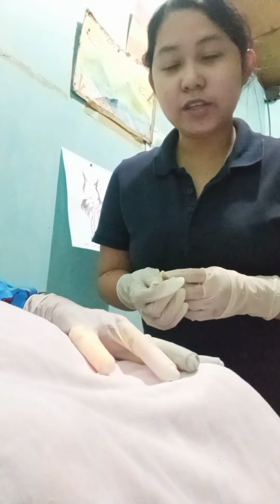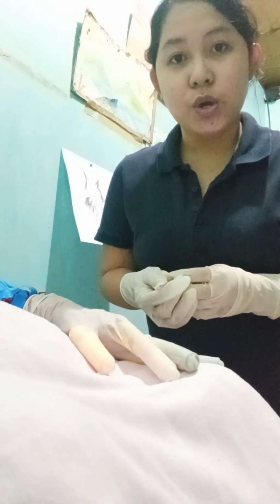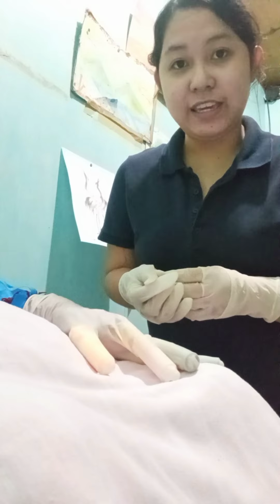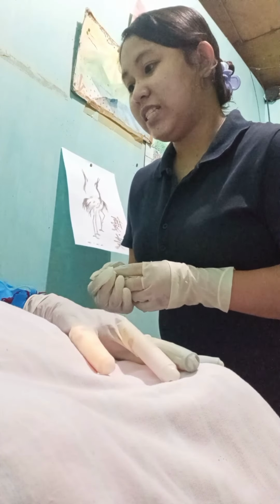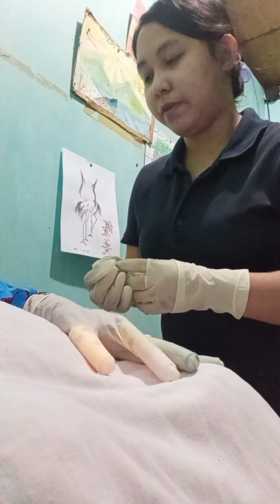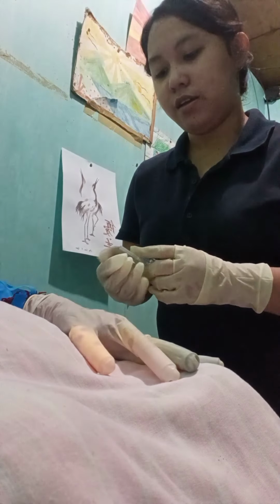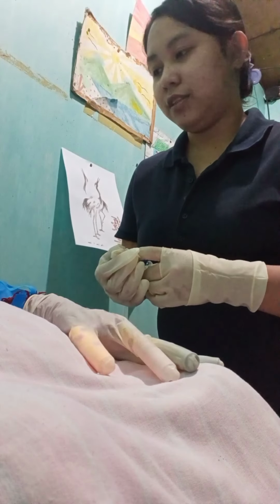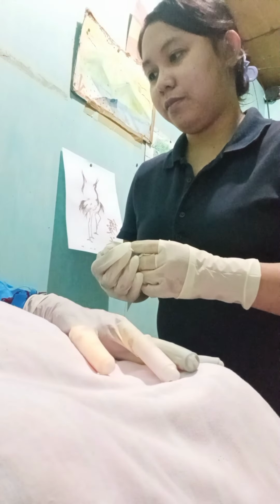And now, encourage your client to take a slow deep breath as you begin the IV insertion. So, Miss Bear, relax and take a slow deep breath as I begin to insert the needle. It may be a little uncomfortable, but relax.